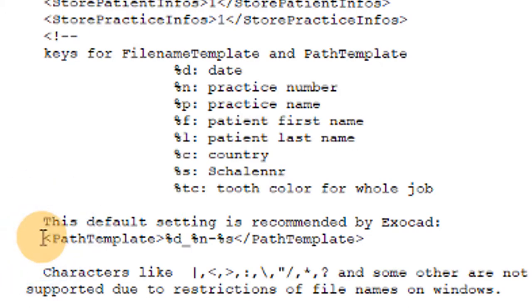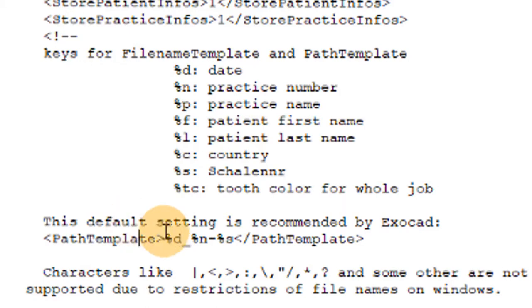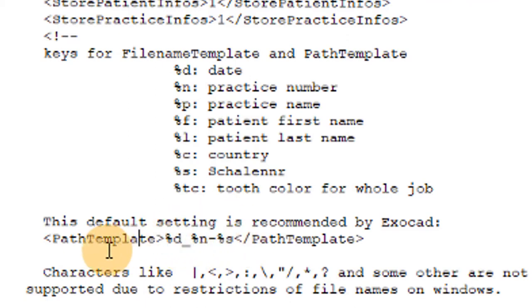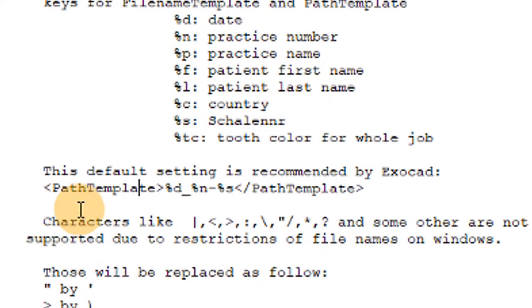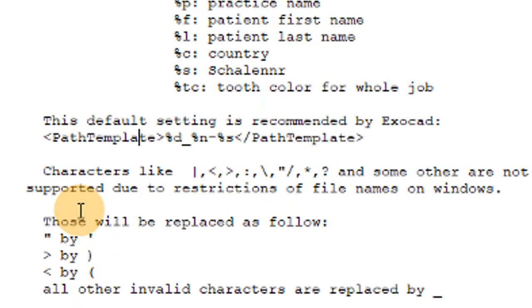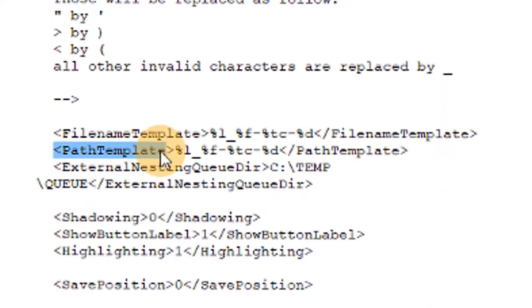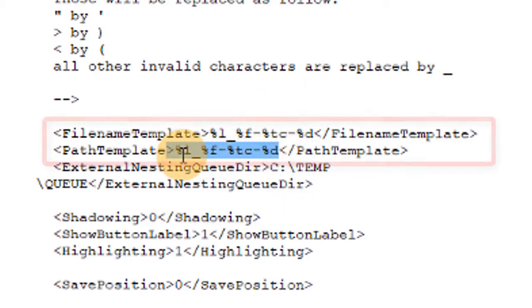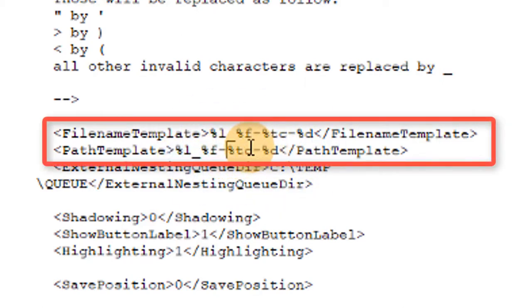What I change is the path template and this is going to be the folder that is made within CAD data. When you make a new project, I have, you can see percent D underscore N dash S, that's the default path. That's the default. You can see for my path template down here, I have last name underscore first name dash shade dash date. So I know the date that I made that project or that I started that project and the patient last and first name.